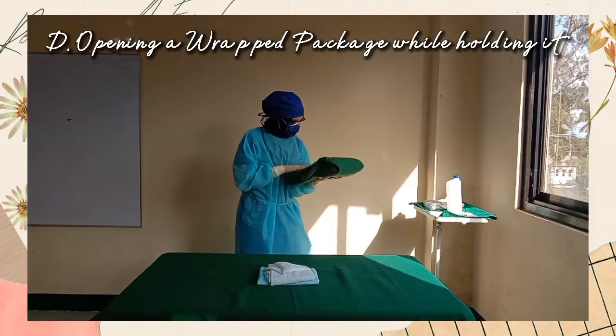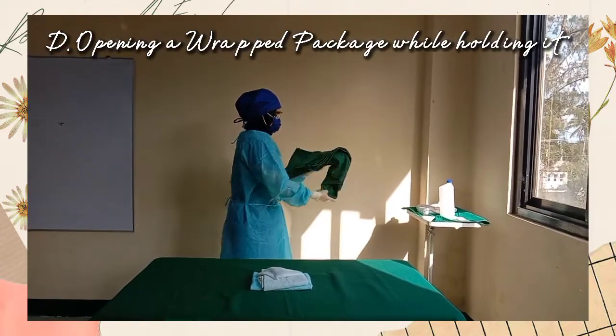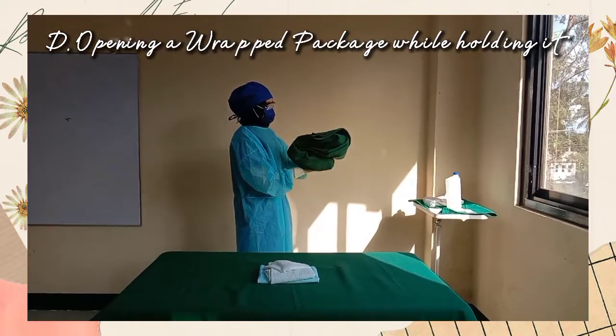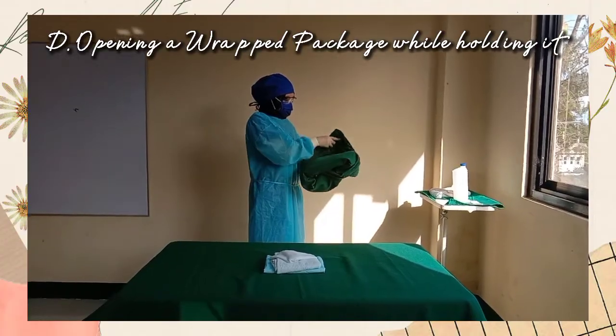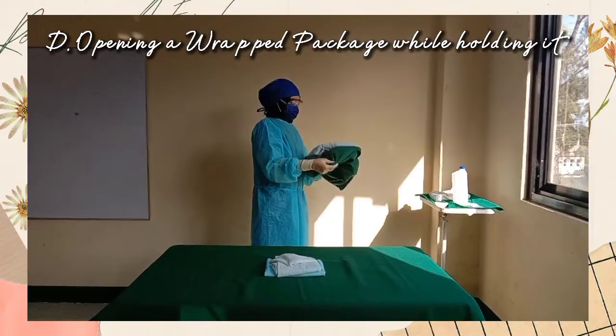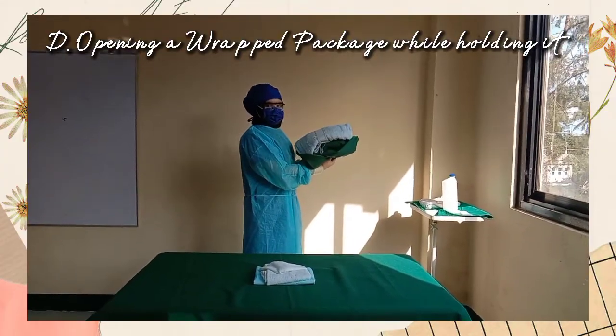Hold the package in one hand with the top flap opening away from you. The hands are considered contaminated, and at no time should they touch the contents of the package. Open the package as described above using the other hand, pulling the corners of the flap well back. Sterility is maintained when sterile objects are placed within a sterile area.